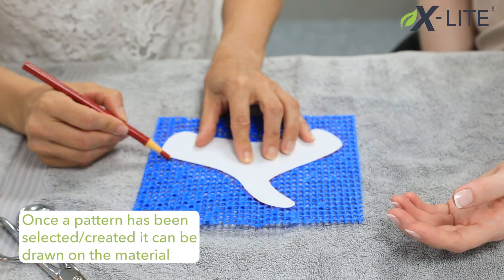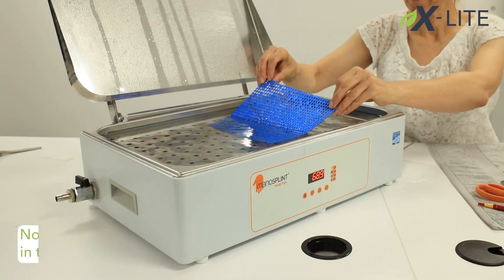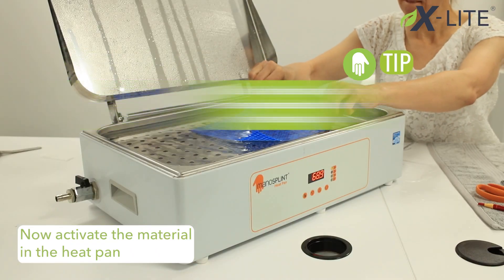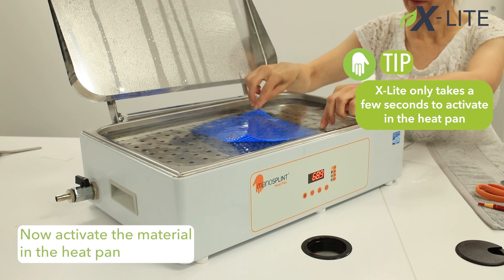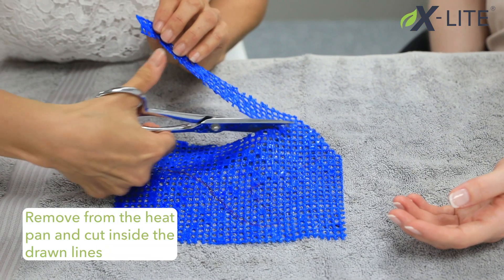Once a pattern has been selected or created, it can be drawn on the material. Now activate the material in the heat pan. X-Lite only takes a few seconds to activate. Remove from the heat pan and cut inside the drawn lines.